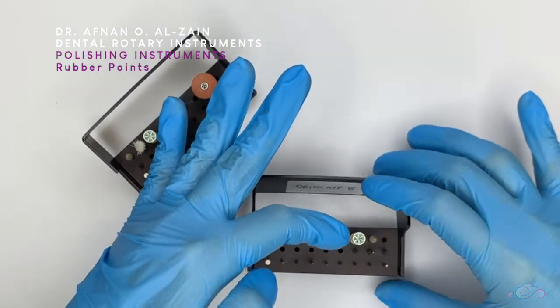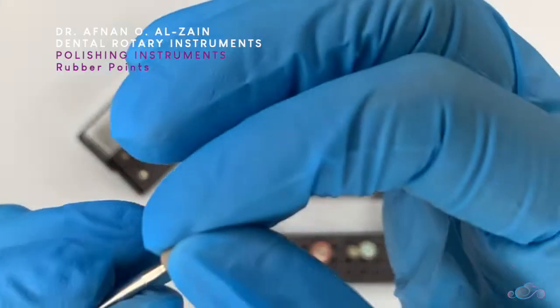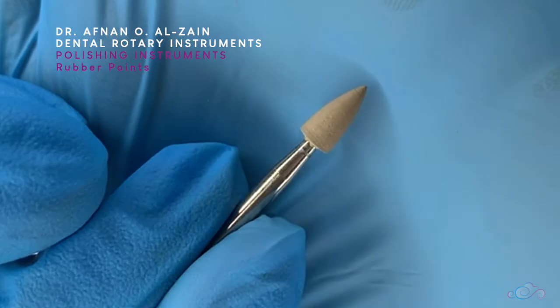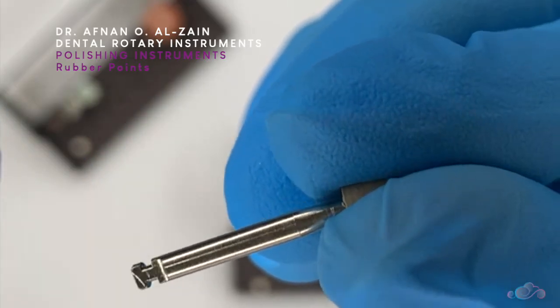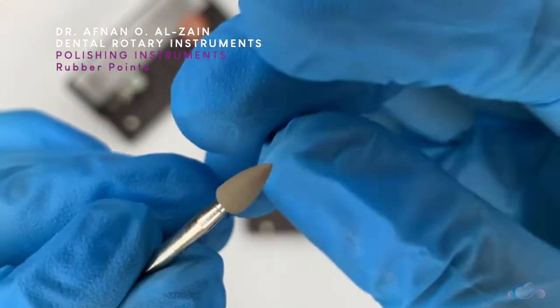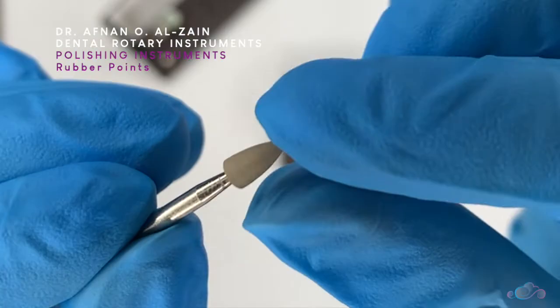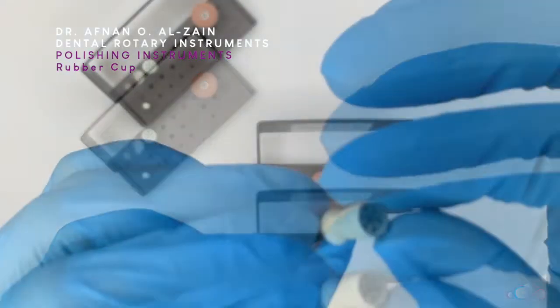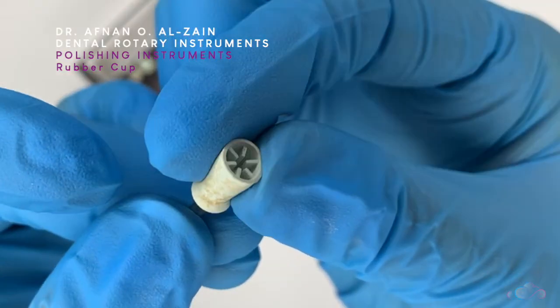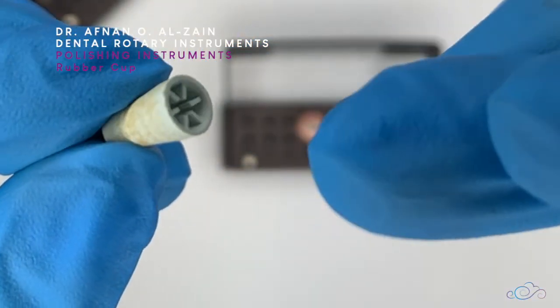Moving on to the polishing instruments — we're going to start with the rubber points. The rubber points also come in different shapes. They are made out of rubber with impregnated granules in it, and they are low speed. Usually all polishing instruments are low speed. It is made out of rubber but it's a little hard — it doesn't bend. You do not need polishing paste with the rubber points. Moving on to the rubber cup — we can see that it is very soft, and you need to use polishing paste with it. You cannot use it alone, unlike the rubber points.